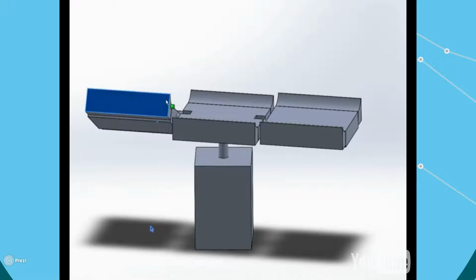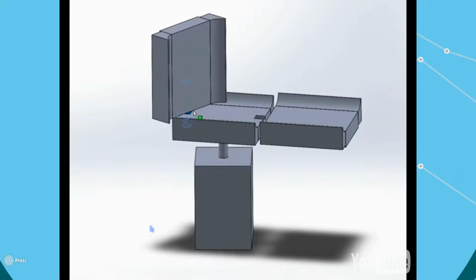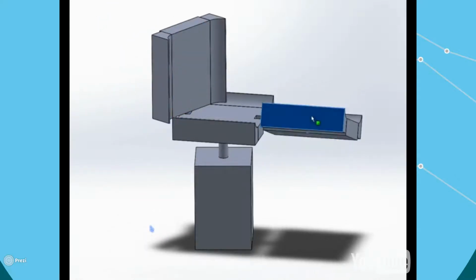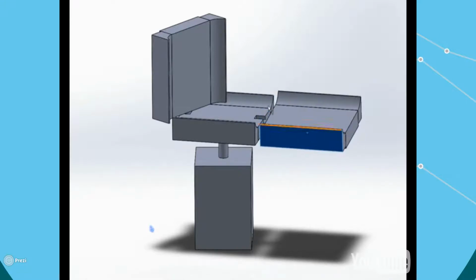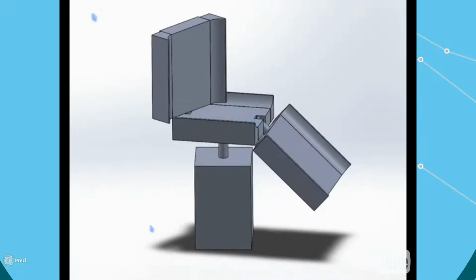This mechanical model is the skeleton of the Freedom Bed. As you can see, the headpiece and the leg piece can rotate with 30 degrees of freedom side to side. They can also be elevated and declined by 90 degrees, which can transform it into a chair. The base can be rotated 360 degrees, allowing the user to see completely around the room. The sides are curved to hold the patient in the middle of the bed.